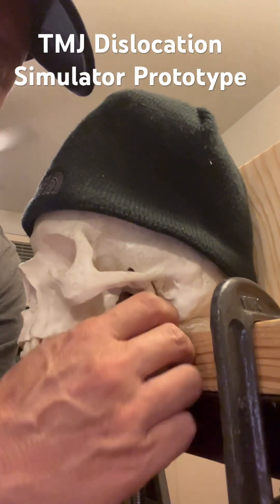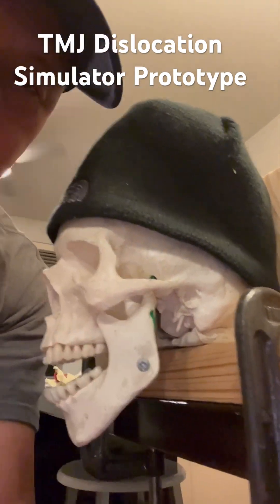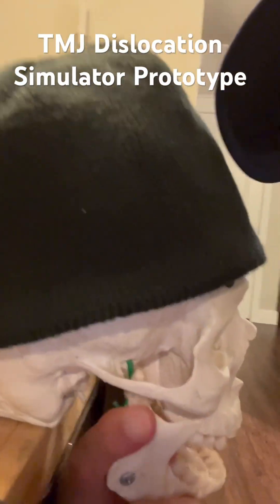So we're going to dislocate one side — dislocate it. And we're going to come to the other side, dislocate it. It's both dislocated.